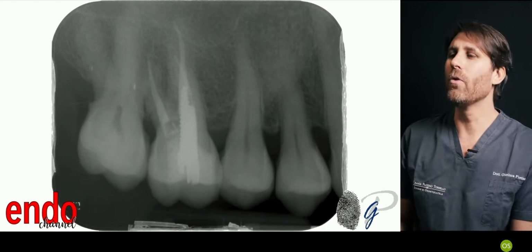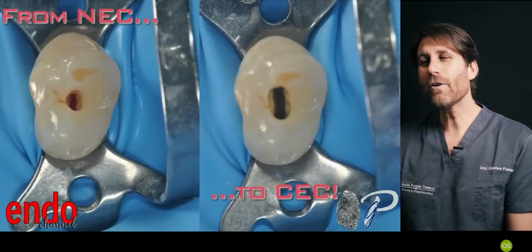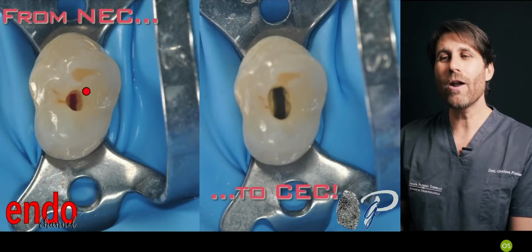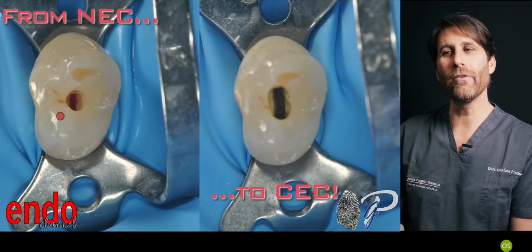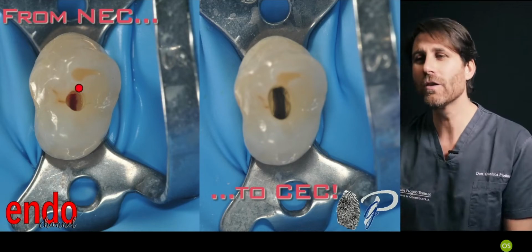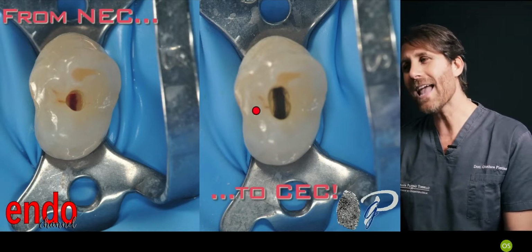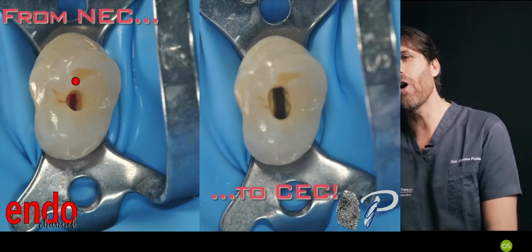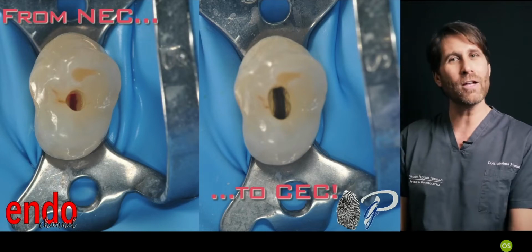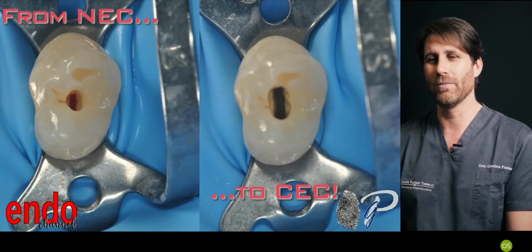The upper premolar, necrosis by trauma: you can start from a very small access like this in the occlusal surface, but never stop there, never finish there. It's not needed to stay so small. You can extend this access cavity a bit, from an ultra-conservative to a conservative one, without reducing the fracture strength of this tooth. So this concept is very important.